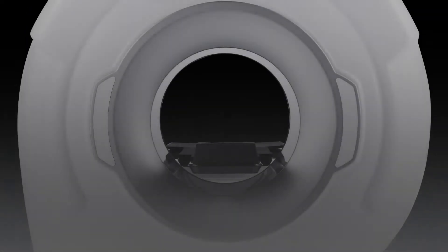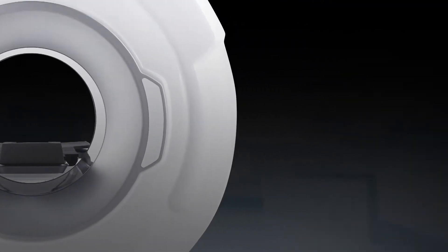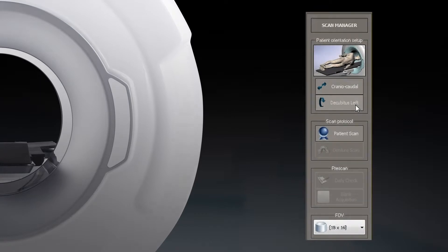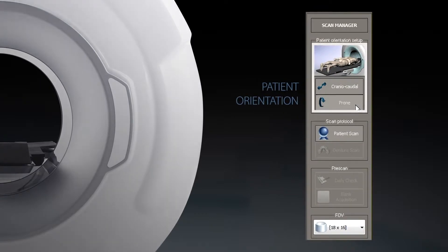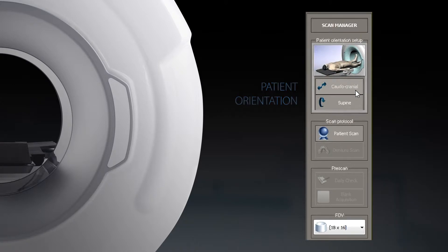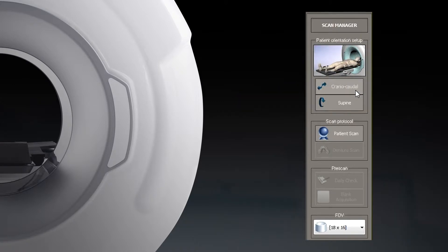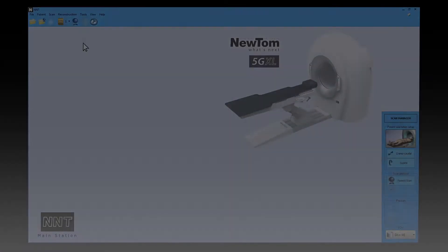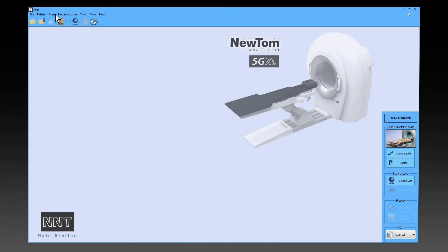Afterwards, the physician uses the scan manager window to submit to the software the patient orientation on the table. From the scan menu, select Ray 2D Acquisition.